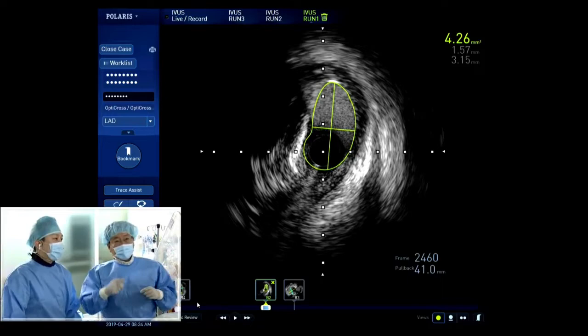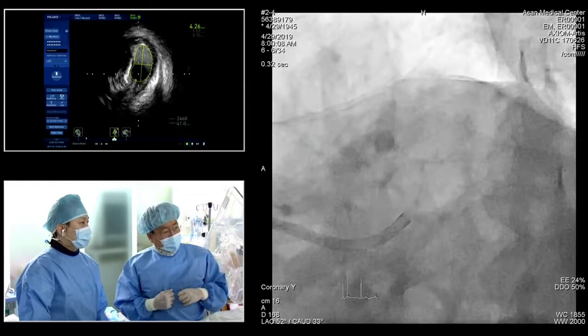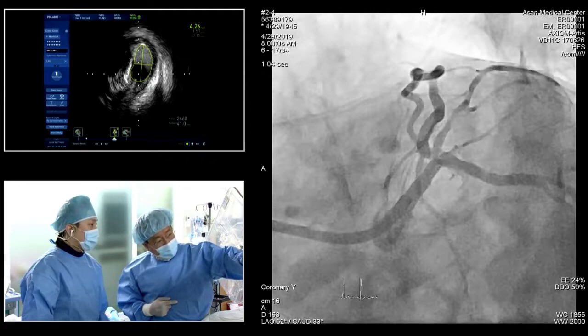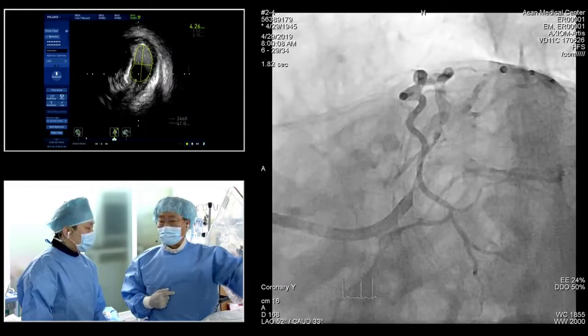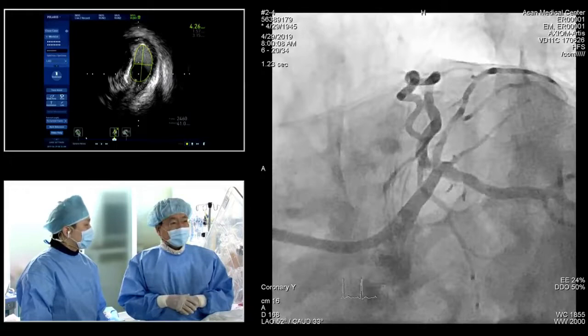Compared with the angio, would you show us the angio? All right. Angiographic findings, we cannot discriminate where the exact disease portion is. However, by IVUS findings, we have a clear idea. The big diagonal and circumflex ostium are good, and the disease is mainly confined to the distal left main, yes. So we have angiographic findings and IVUS findings, and would you discuss how to treat this patient?